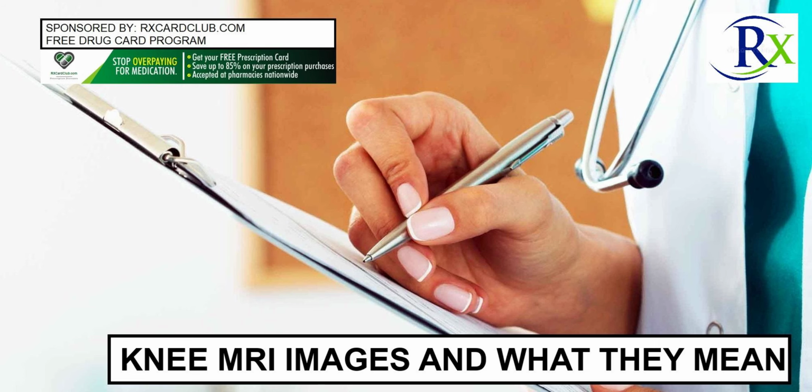On an MRI, fluid buildup inside the knee appears bright white or whitish. The presence of fluid inside the knee is an indication that there has been some sort of trauma or damage to the structures inside the knee.